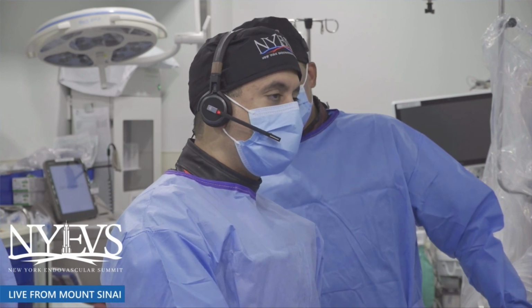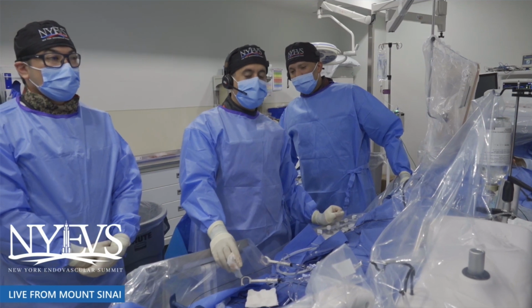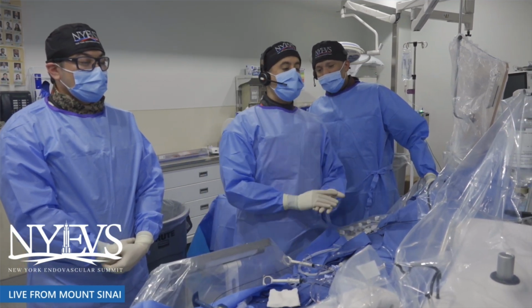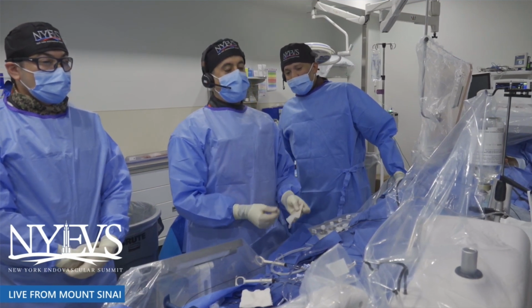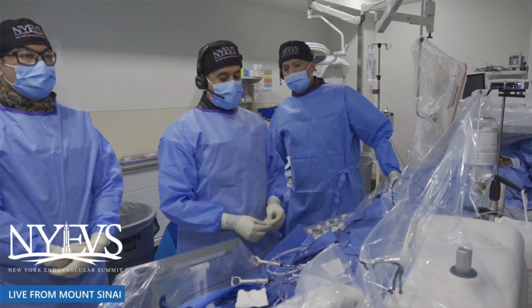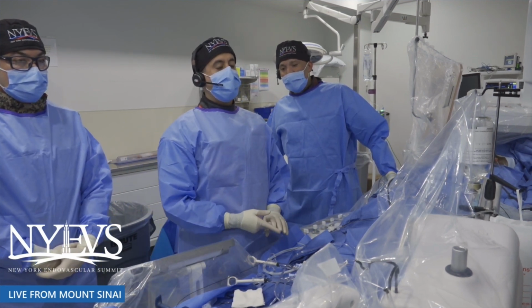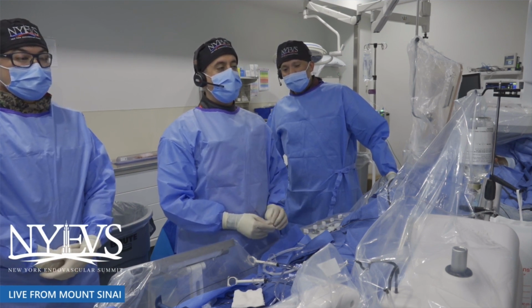Because she's having just lifestyle-limiting claudication, we want to see if the iliacs will take care of her claudication. So we're going to fix the iliacs and probably stage her for infrainguinal lesions if needed. Right, with the ABI of 0.25, that's consistent with almost CLI. Most likely 0.25 is from the multi-level disease, but again, it's claudication. If you have inflow iliac lesions, we'll do that. Usually our practice is to monitor them for a month and see how they feel, and based on the symptoms, we decide how aggressive we have to be with infrainguinal lesions.